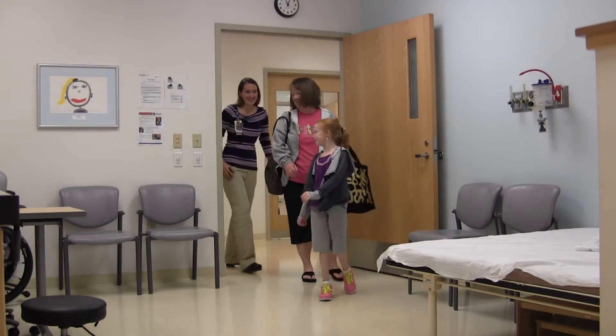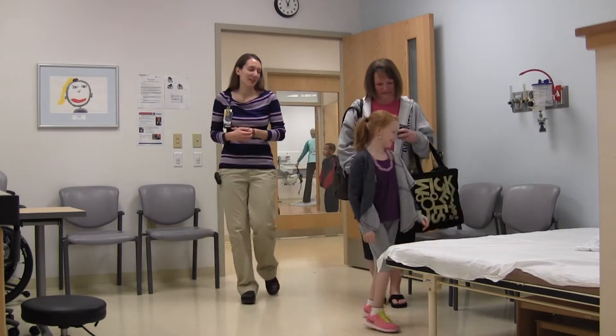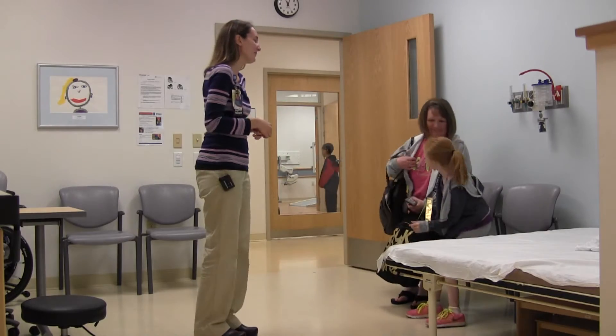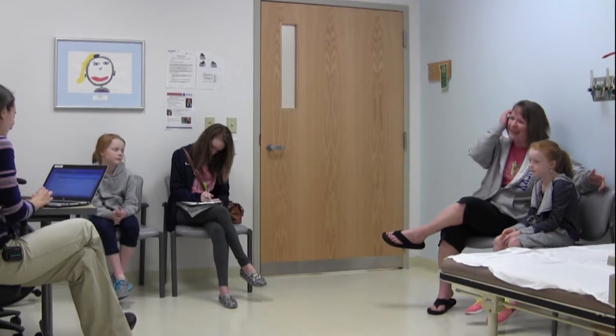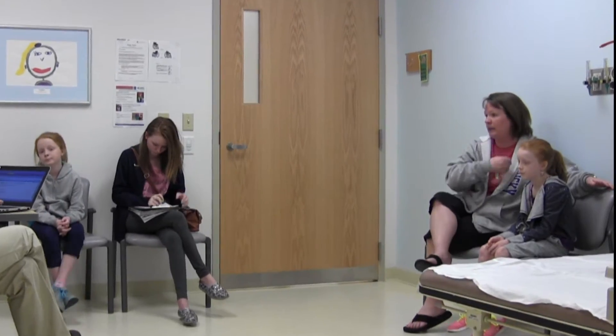Some kids go to the motion analysis lab to find out how to help with their walking. This video explains what your appointment will be like and all the different things that you might do. This is my visit, but everyone's visit may be a little different.